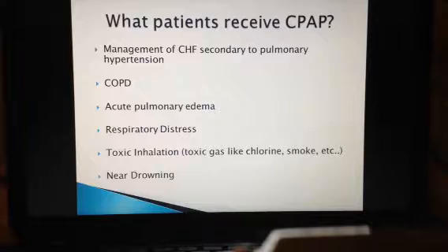A lot of times, many of these patients are going to receive advanced airway devices, but research has shown morbidity and mortality when these types of patients receive intubation for their condition in the field. CPAP has shown great results with a lot of these patients, but it does not always help. And then also, you also see CPAP used for obstructive sleep apnea, where they wear this CPAP unit at night, and it helps to maintain their airway.